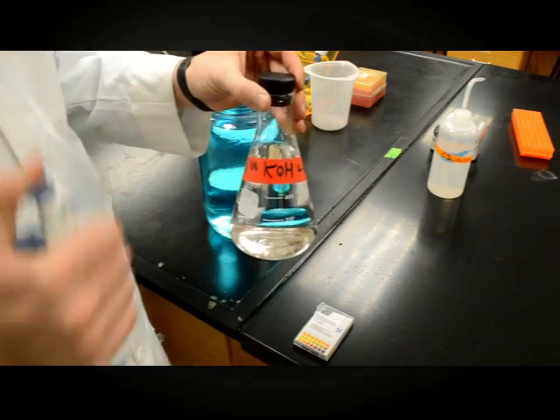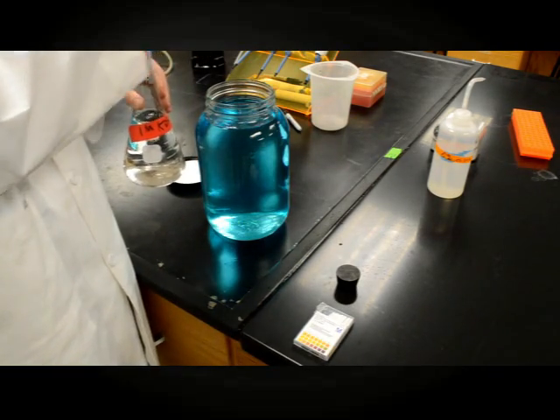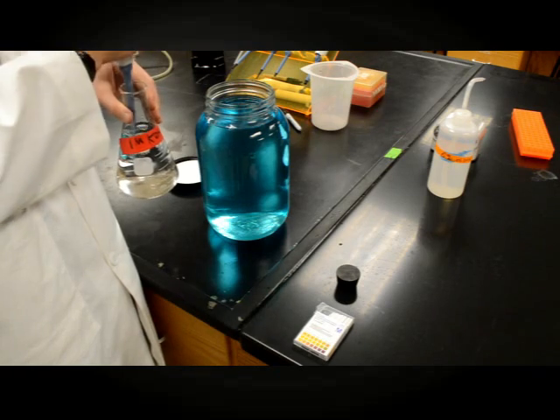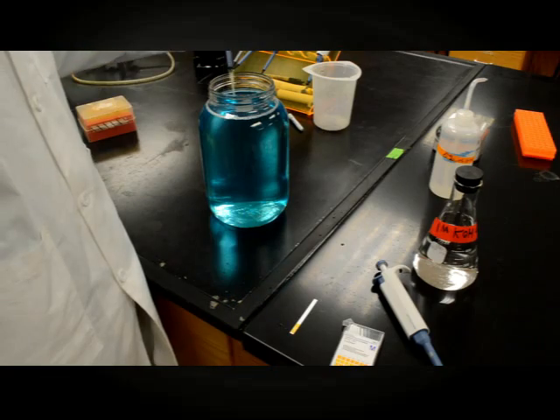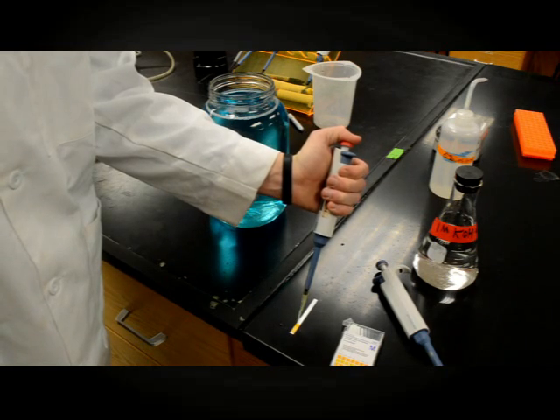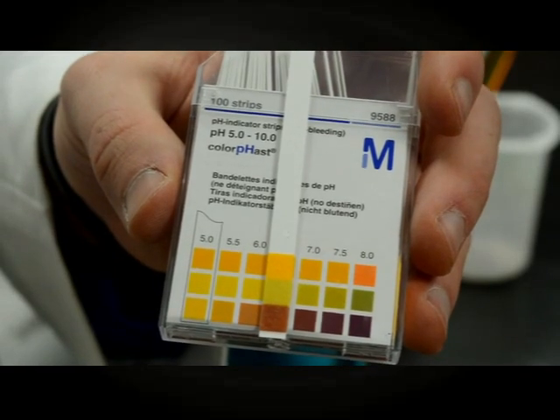Add 1 molar of a base until the pH is 7.0. Generally, it'll take about 8 milliliters of 1 molar potassium hydroxide to bring the solution to neutral. Using pH strips or a pH meter, make sure the pH is near 7.0 for most algae species.